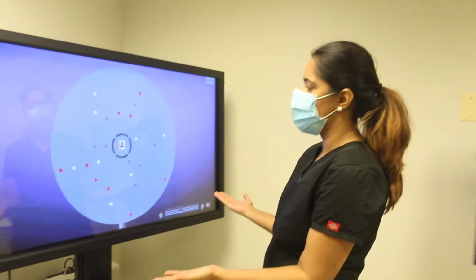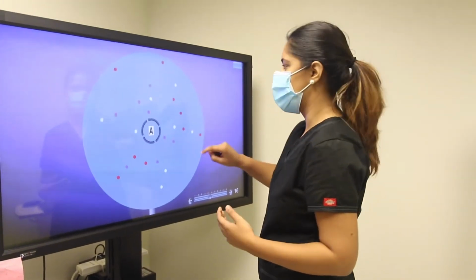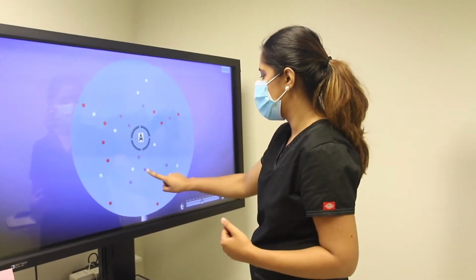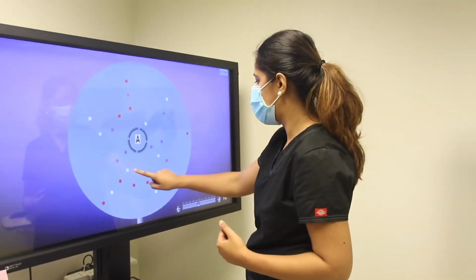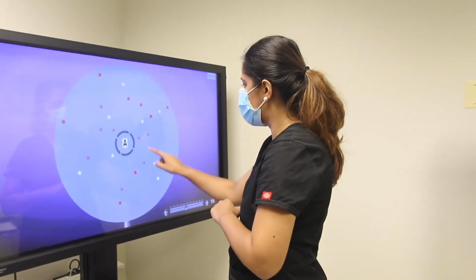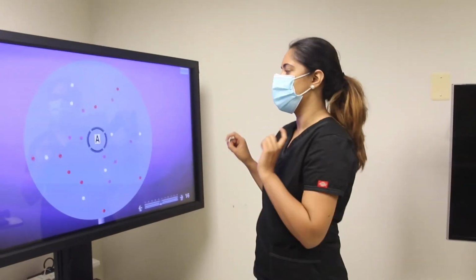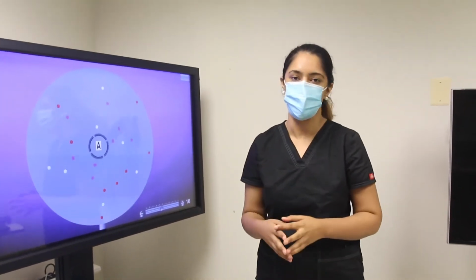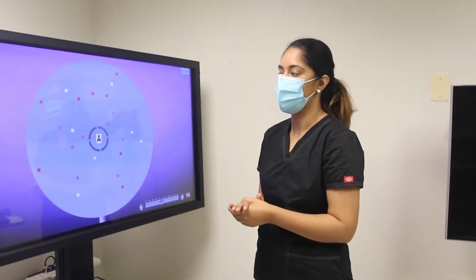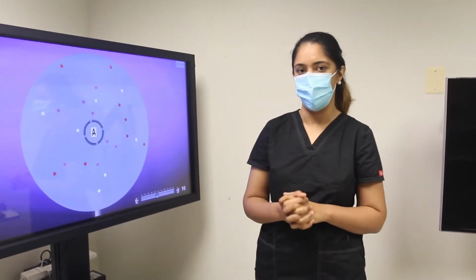Basically, you are looking at this and you are pressing circles. That's not working. So basically you're using your hands and pointing at different circles and symbols, and you have to use both your hands and your eyes together to complete these activities, and how well your eyes work together gets practiced in here.